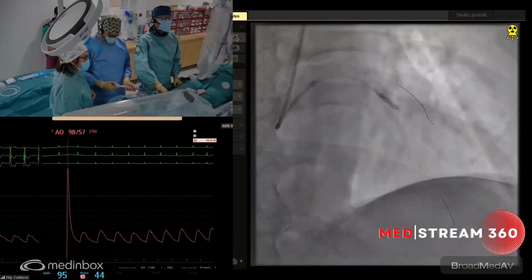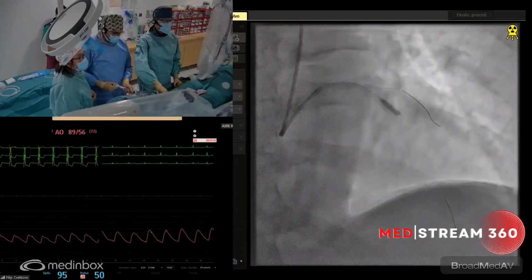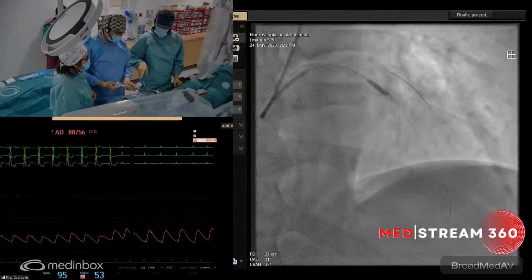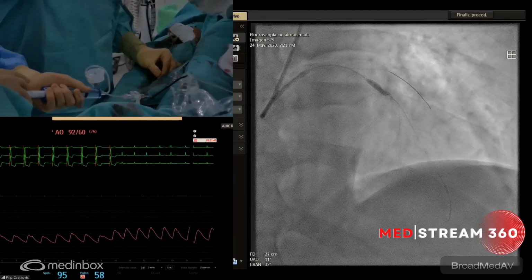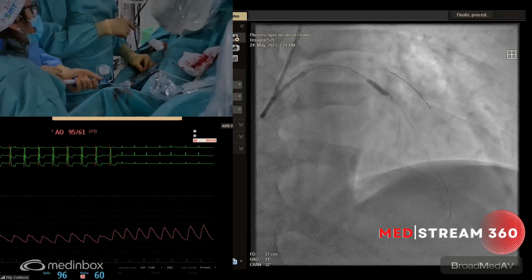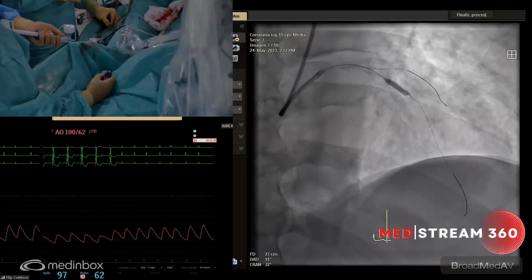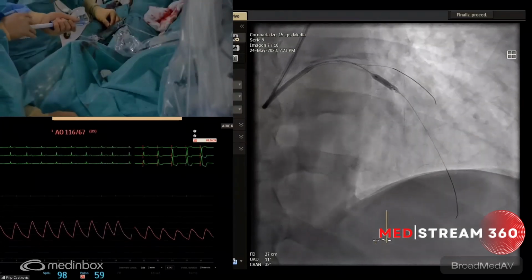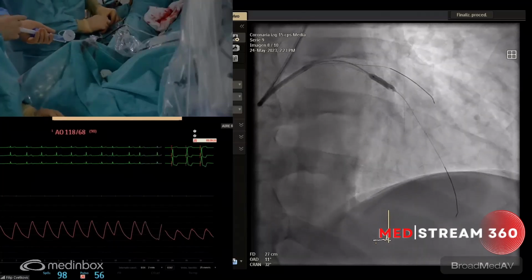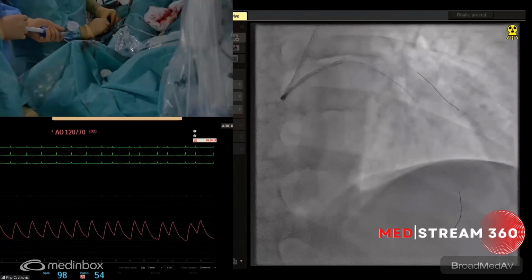And I'm applying the pulses. And after that, we're going to 6 and wait for the signal, for the acoustic signal. You can see the shock top is there, the capture of the ventricle with the shock wave. Okay, down. Okay, and probably I'm going proximally to dilate. Okay, there.